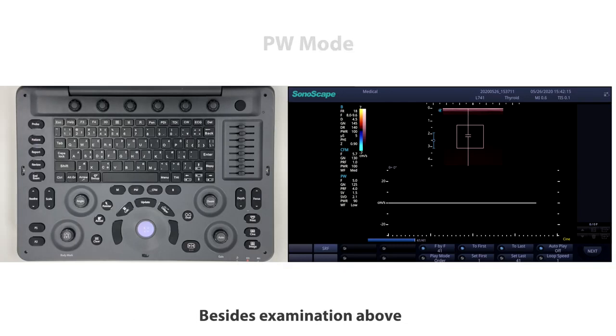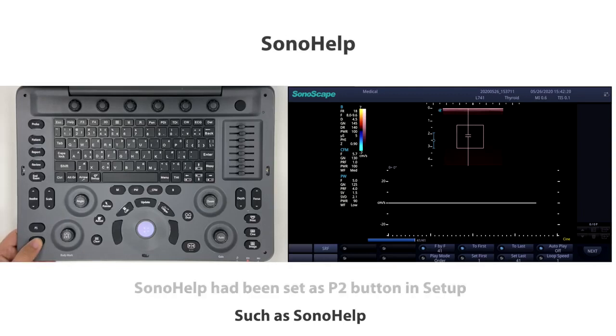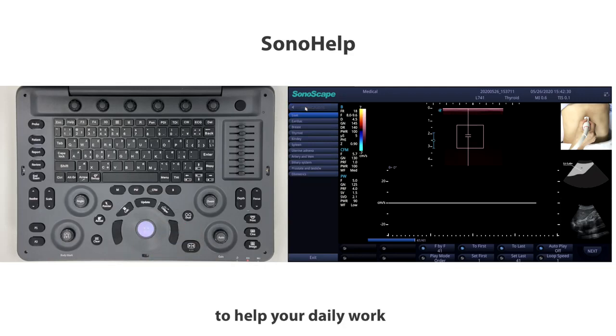Besides the examination above, E-Series is also equipped with practical functions for your efficiency, such as SonoHelp, which could provide you guidance of exam. Other valuable function buttons are also displayed on the keyboard to help your daily work.